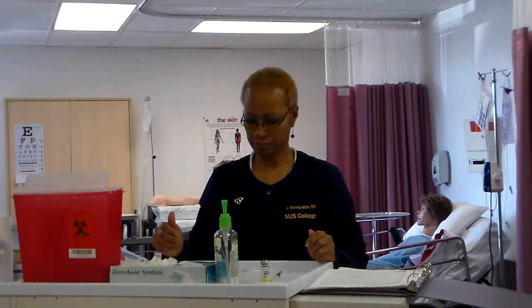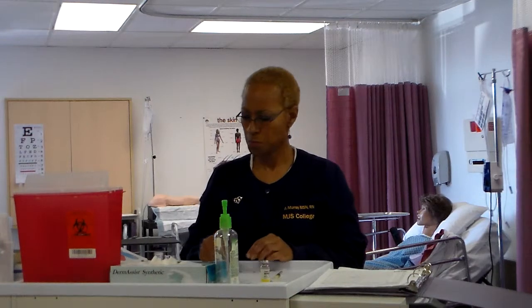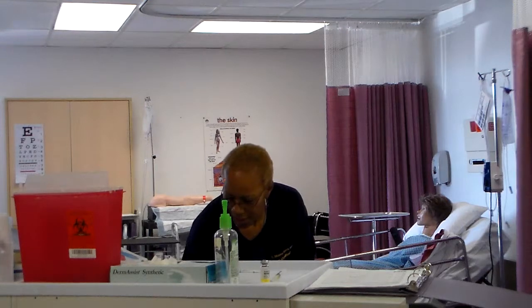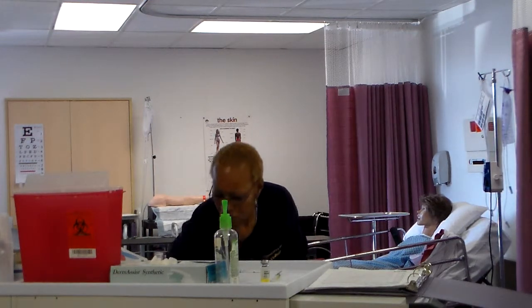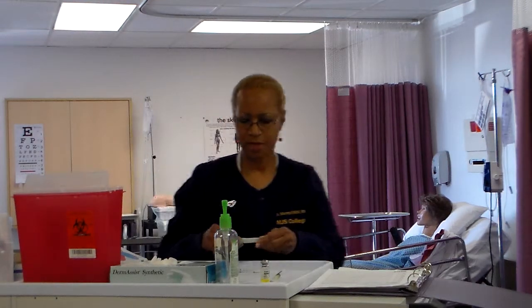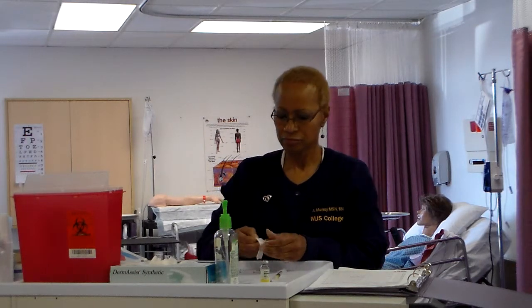If medication will be injected into client's tissue, change needle to appropriate gauge and length according to route of medication. Okay. So if that's going to be an IM, I'm going to switch my needles.